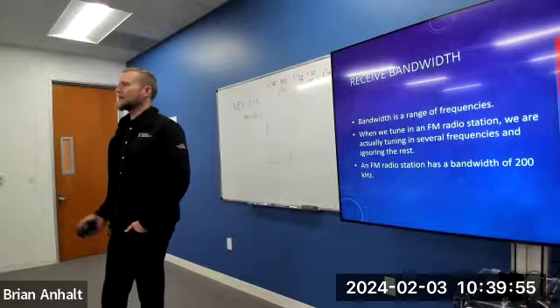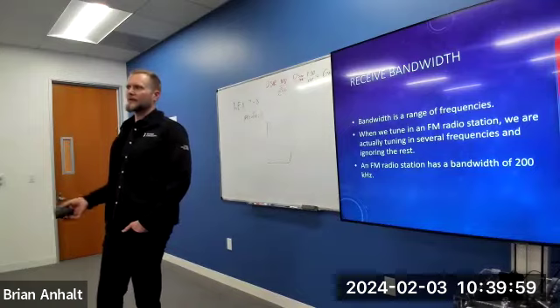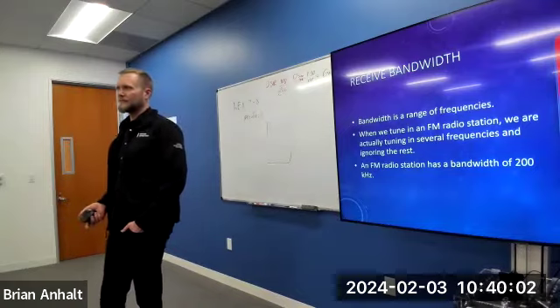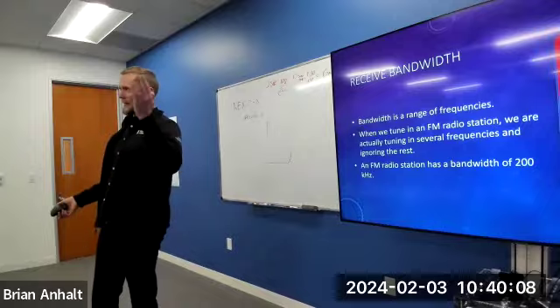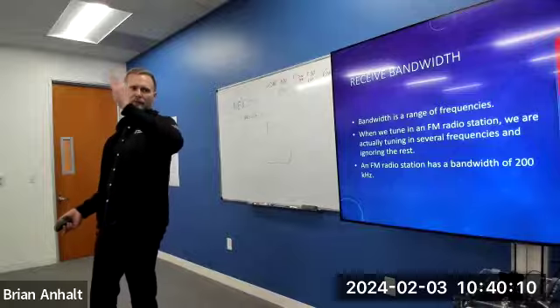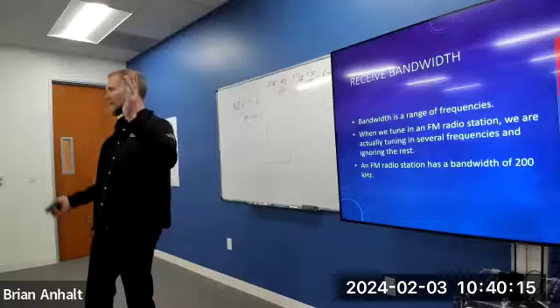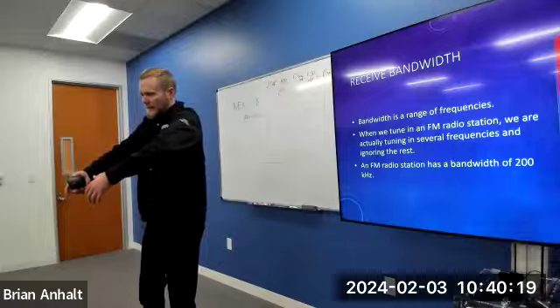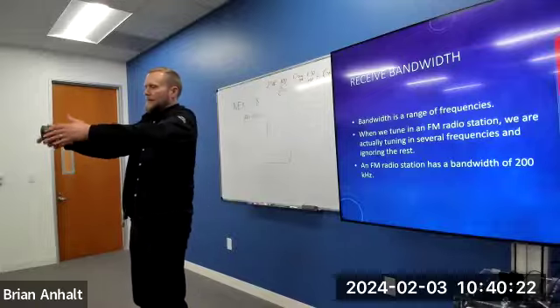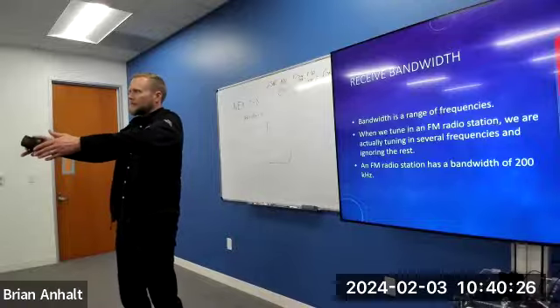Receive bandwidth. People get scared by bandwidth. You hear the word all the time. How much bandwidth do you have? What is bandwidth? I want to make it simple for you. It is a range of frequencies. That's all it is. A frequency, remember, in an MRI, is how many times that proton is precessing past the coil in a given second. So it's in megahertz, right? A range of frequencies would essentially be that frequency and then many others, right?